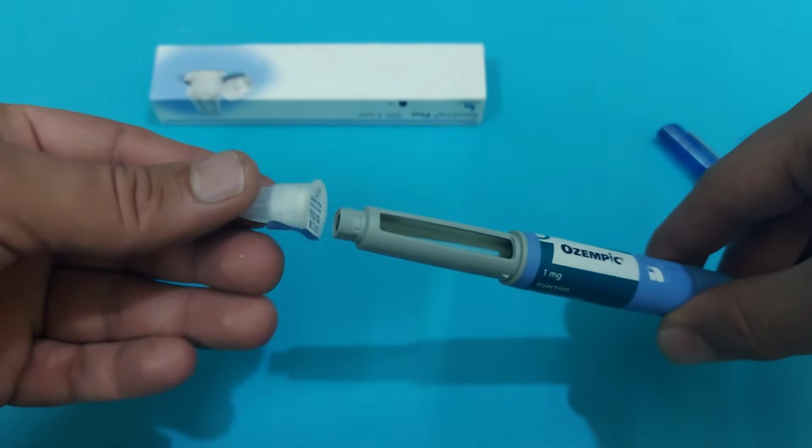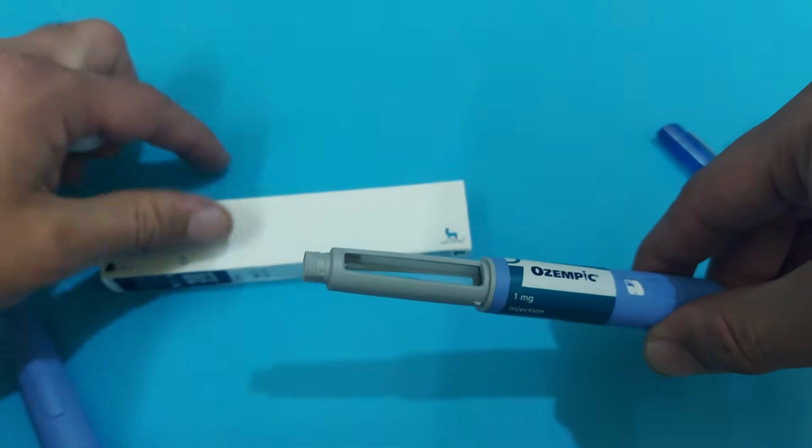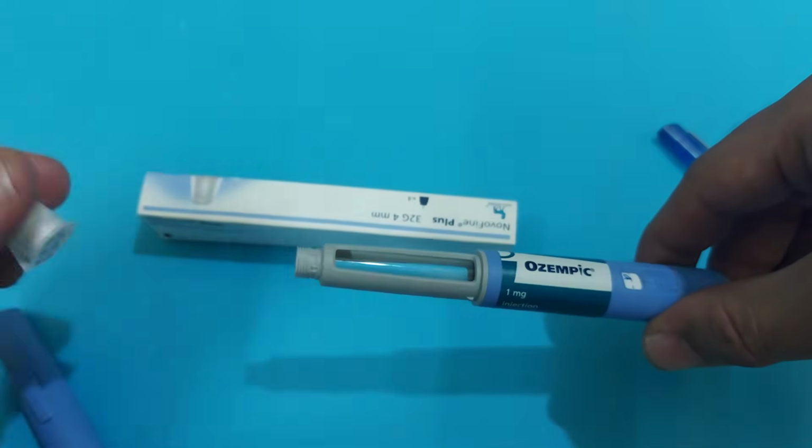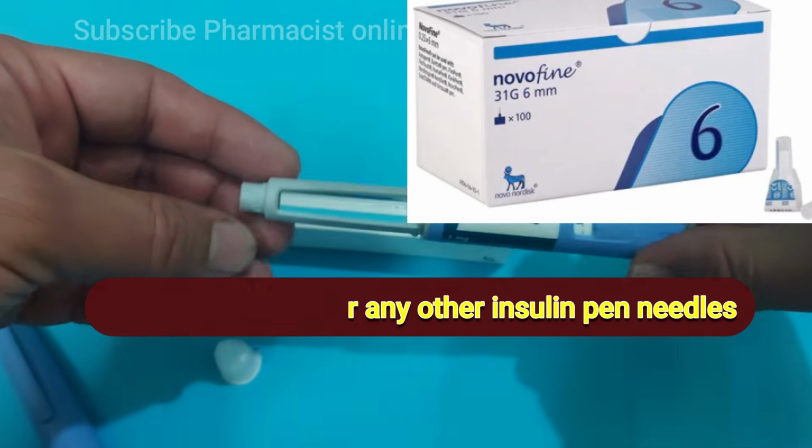You can use this needle, but it has limited stock here, only 4 injections for 4 doses, so when it is finished you can use NovoFine needles or any insulin needles for this pen.